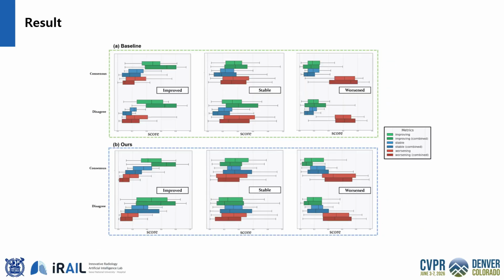MS-CXR-T labels each case as consensus or disagreement. Disagreement signals an ambiguous case. On consensus cases, TILA sharpens the margin between classes: confident answers when the ground truth is confident. On disagreement cases, it stays conservative, mirroring radiologist uncertainty.